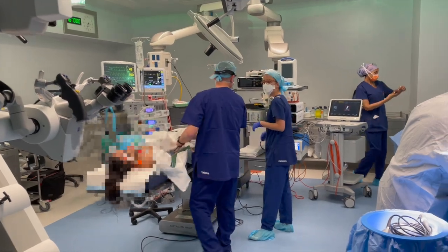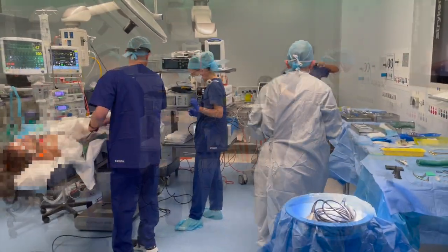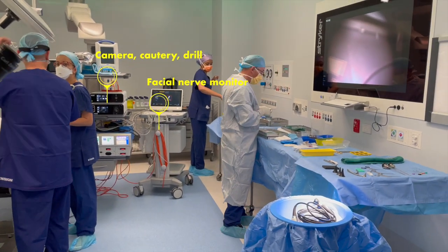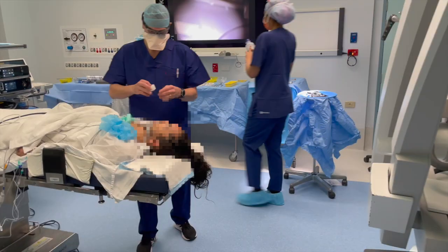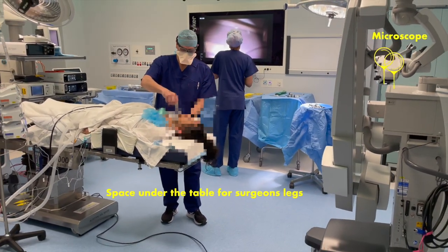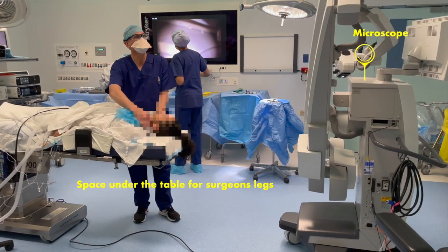Here we present the operating room setup for a left ear, with the cord, the drill, the camera, and the facial nerve monitor all at the foot of the patient. A microscope is always present in the room, with significant space under the table for the surgeon's leg if they choose to sit down.